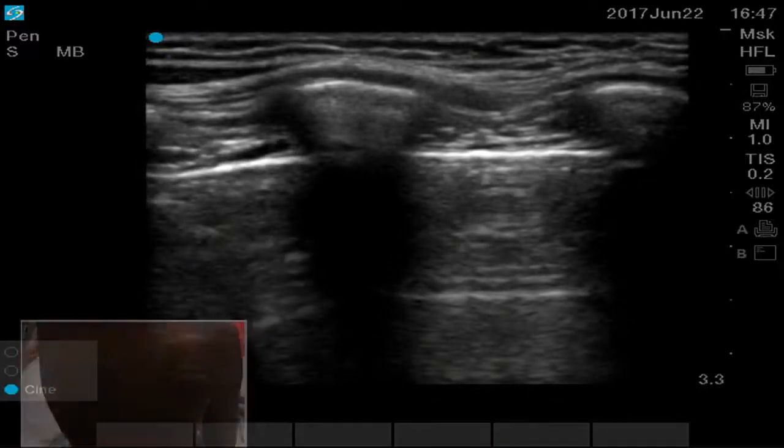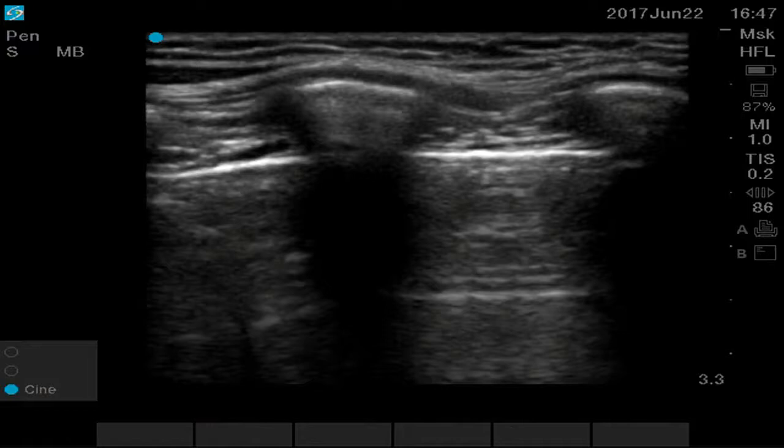So this is the cephalad, this is the head end, this is the foot end. So this is the lower part of the rib. So you can hit the rib and then walk off so that you will get the neurovascular bundle at this. If you can clearly watch, this hypoechoic circle is nothing but an intercostal artery, and this is the area where the neurovascular bundle lies. And that is how we will give the intercostal blocks.